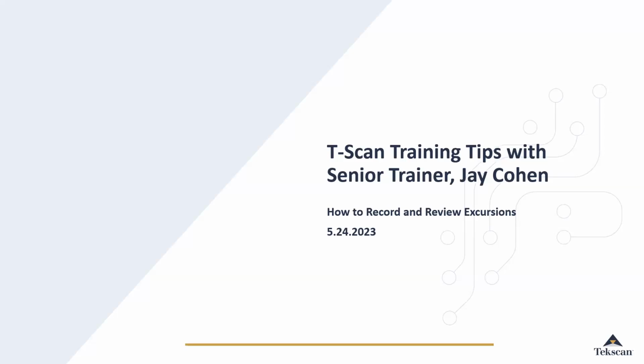Today's session is about excursions. As you all know, excursions are a complex subject, and I could talk about it for hours. But due to time constraints, I'll be focusing on the basics for recording and reviewing occlusion with the Tekscan.